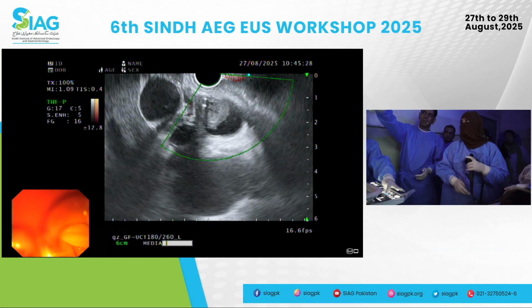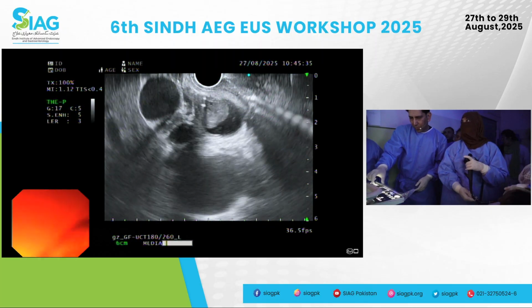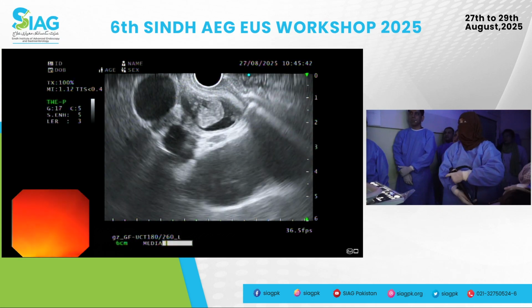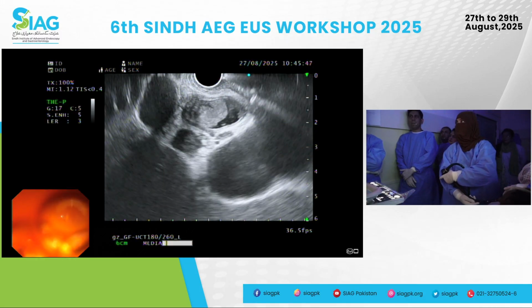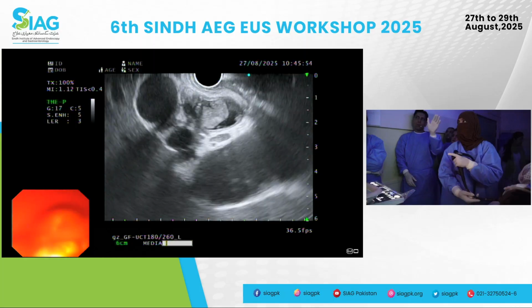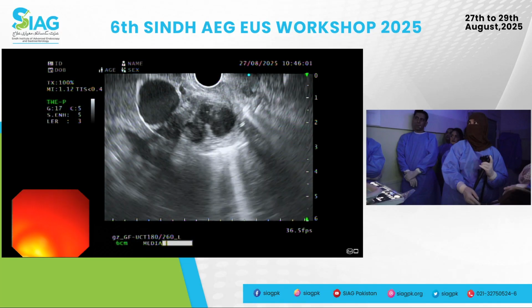And then obviously surrounding the stent there's a lot of debris. Score it, please. Where's the pointer gone? Pointer. Exactly. So yeah, all this is sludge with a stent in situ. Okay. So what you can do is follow it clockwise to the ampulla. If we go clockwise, we will reach the ampulla. Yes. And if you go anti-clockwise, you're going to go toward the liver hilum. Yes. Good, good, good. Keep going.